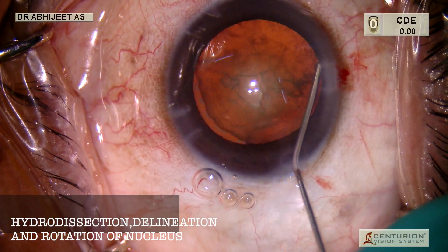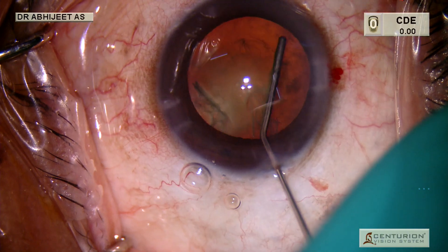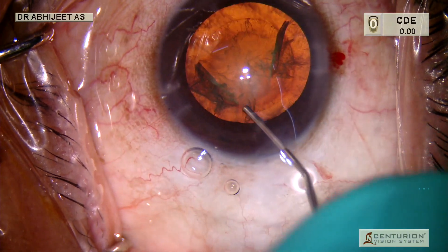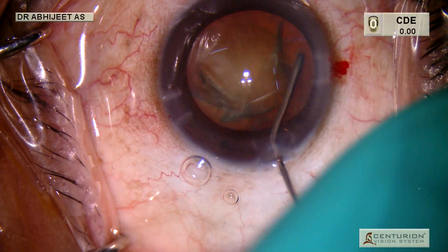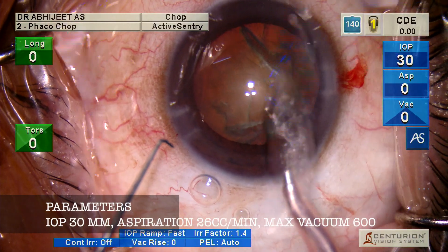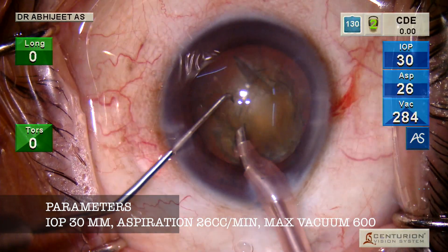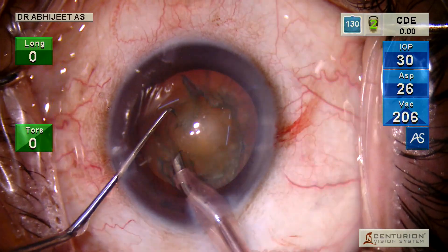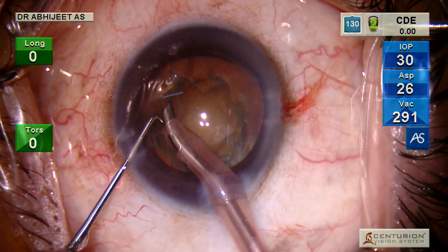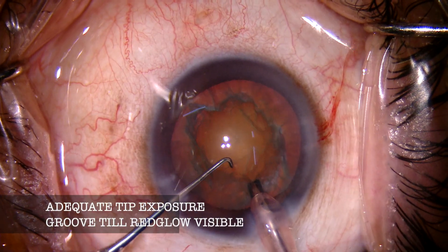Using a 27-gauge cannula we do a hydrodissection, and always remember to tap on the other side for the fluid to come out so that it doesn't get trapped and cause a PCR. The parameters here are 30 mmHg IOP, an aspiration rate of 26, and a maximum vacuum of 550–600.